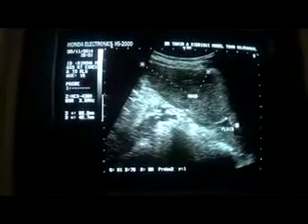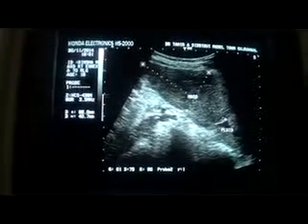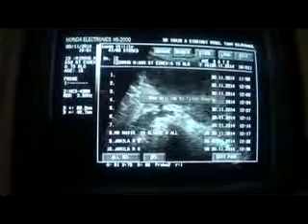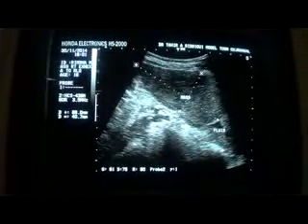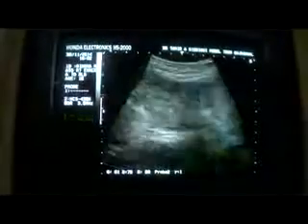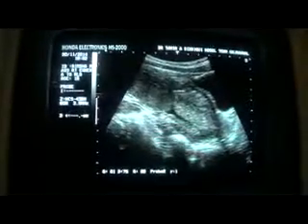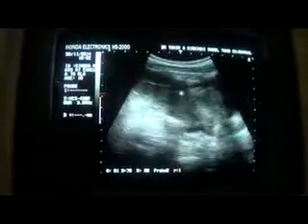This is the part of the uterus we are seeing, and we can see this mass extending from the region of the pelvis up to the, now again to show you the uterus. This is the uterus, and this is the mass.